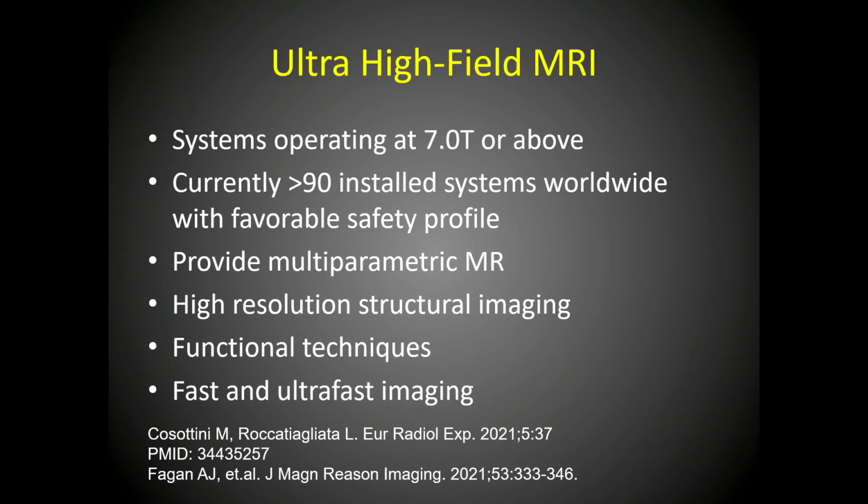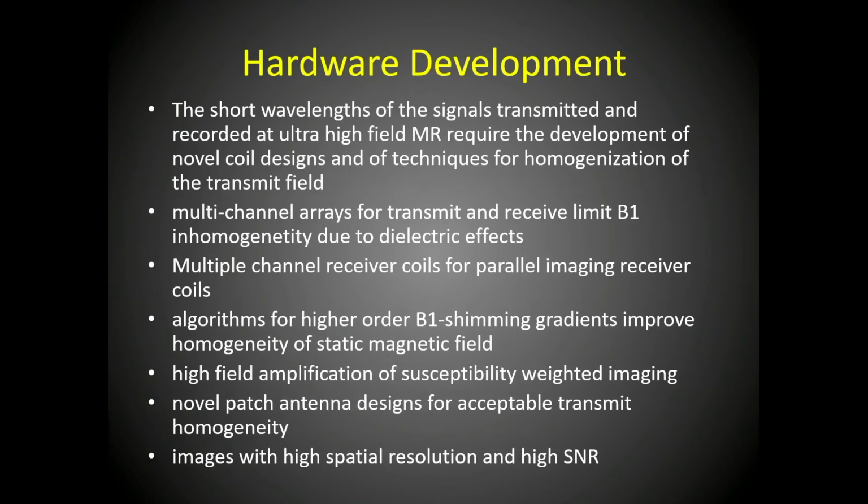All of these scanners are able to provide multi-parametric MR, very high resolution structural MR imaging, beautiful functional techniques, and fast and ultra-fast imaging, which opens up some exciting avenues as well for temporal analysis of physiologic changes in the body.